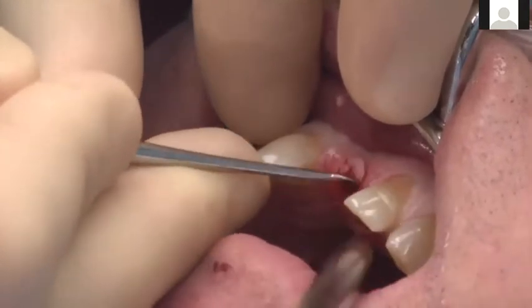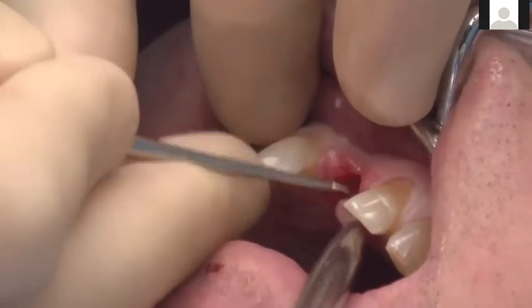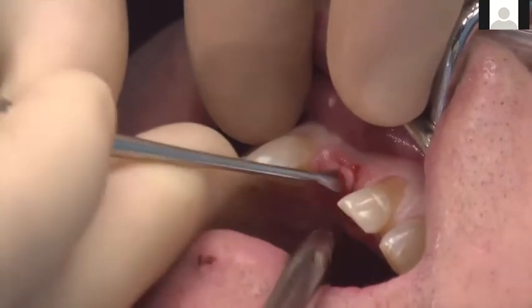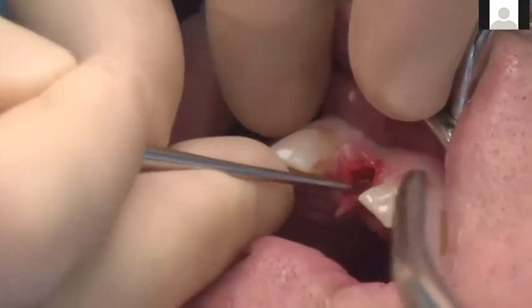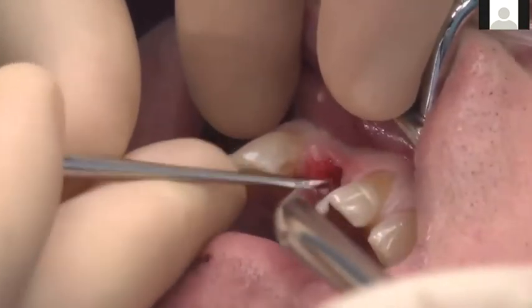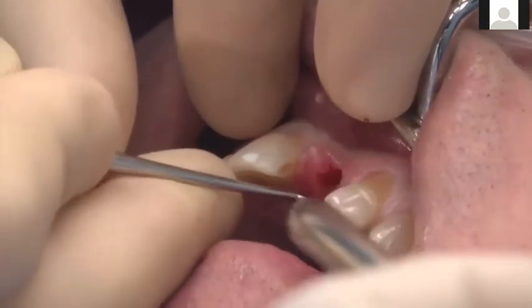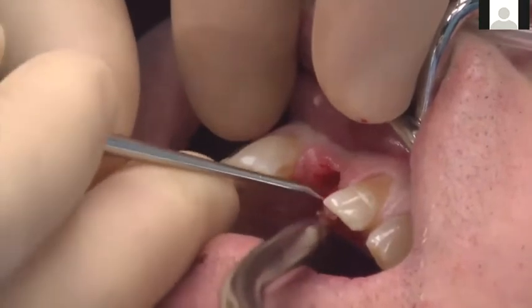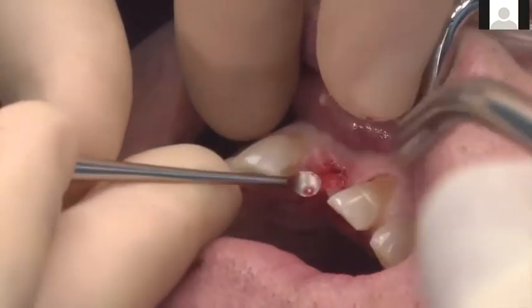This is something that we take a little bit of time doing so we can get a really clean punch out. And obviously you only do the punch when you have enough bone and enough keratinized tissue, such as in a case like this. Here, as you can see, we have that buccal concavity, but remember, we're going to do a connective tissue graft there, so we can still do a punch and do a tunneling underneath to place a connective tissue graft, which you will see done later on, or you'll see the finished product.